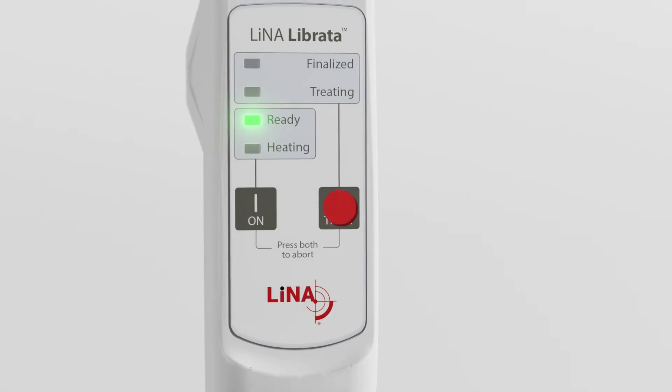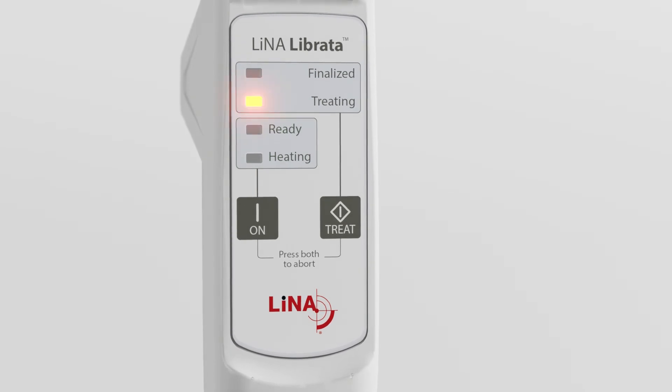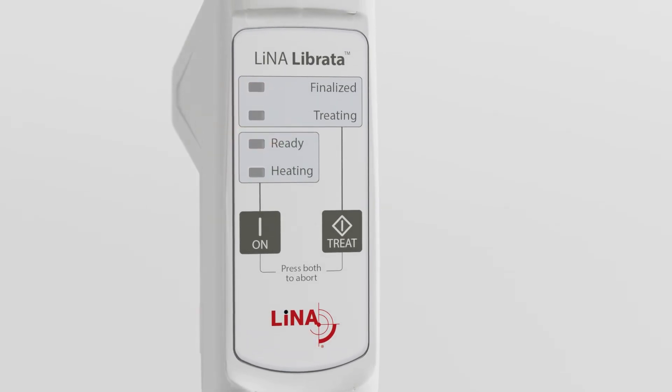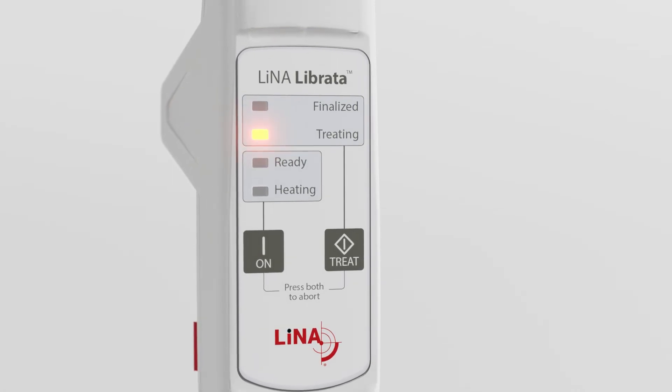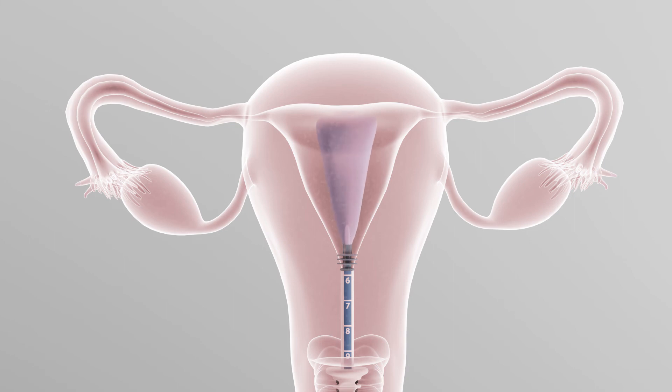Press the treat button and Librata's intelligent software then automatically manages the time, temperature, and pressure. During the treatment process, the balloon will inflate and deflate five times.